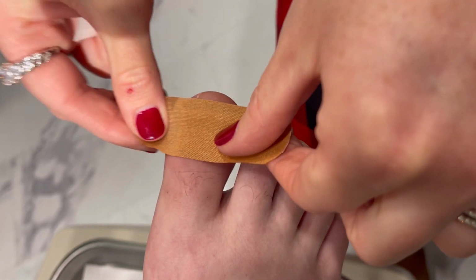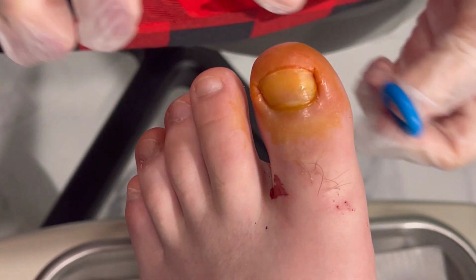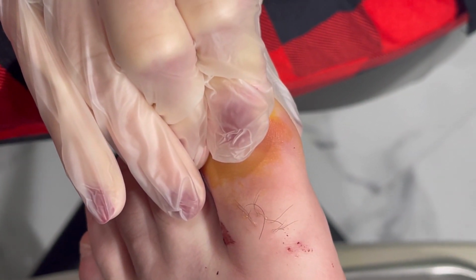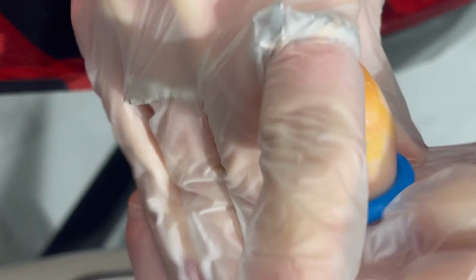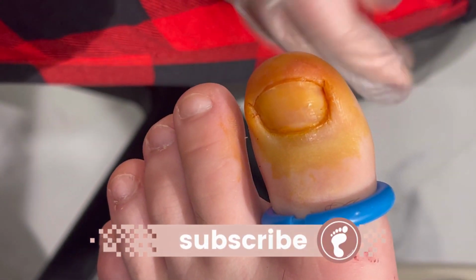All right, we're waiting on the other toe. We'll be back momentarily. This is our tourniquet. We are back. We're gonna test him and see if he can feel something. What do you feel? Pressure? Sharp? Shooting? I feel pressure, and I felt kind of tingly. Okay. Tingly is nerve. That's good. Tourniquet goes on. I use a tourniquet because I don't like blood everywhere.